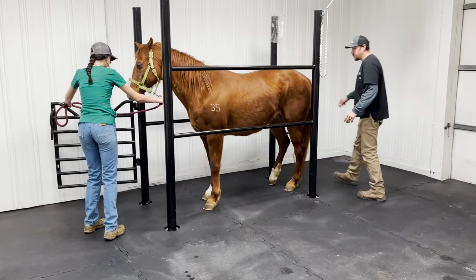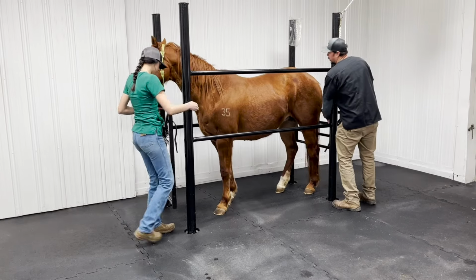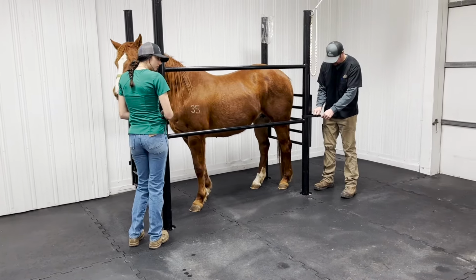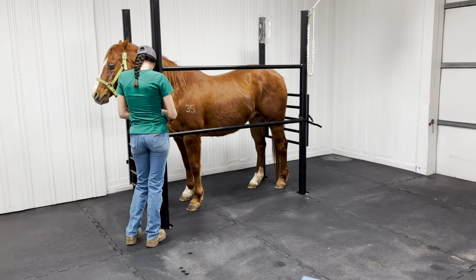All right, in this video, you're going to get to watch a standing surgery for our horse here called Amazon, who's got a bad eye problem. And after much effort, we're going to end up having to remove this eye.